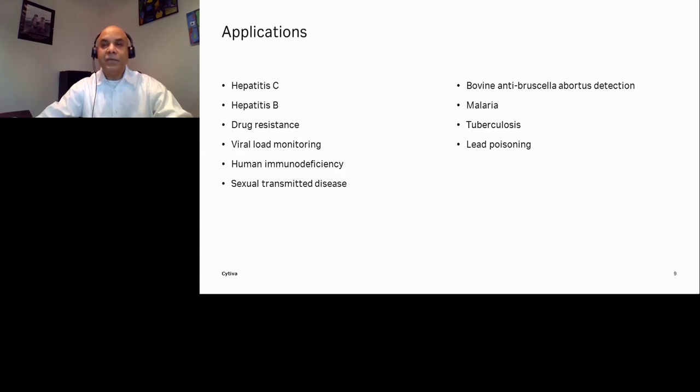But DBS was compared with serological assay by parallel testing of DBS and sera, which showed 99 to 100% concordance. Furthermore, laboratories at the Centers for Disease Control Atlanta extended the screening quality assurance program to include test panels of anti-HIV positive and negative DBS, which were distributed throughout the USA and overseas. Subsequently, a similar quality control program was made available by the Central Public Health Laboratory in London. Since the inception of anonymous screening, several million DBS have been tested, enabling accurate data to be obtained about the prevalence of HIV-1. Similar surveillance has been done for human T-cell leukemia or lymphoma virus.